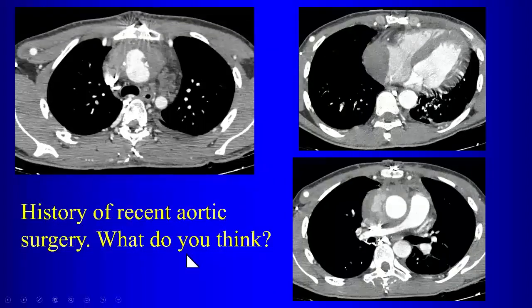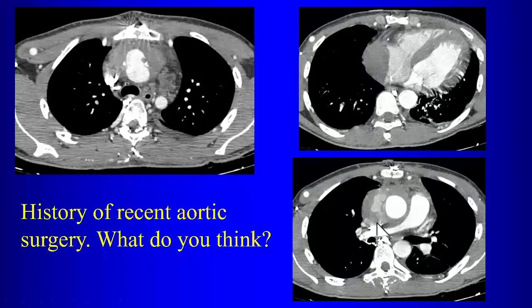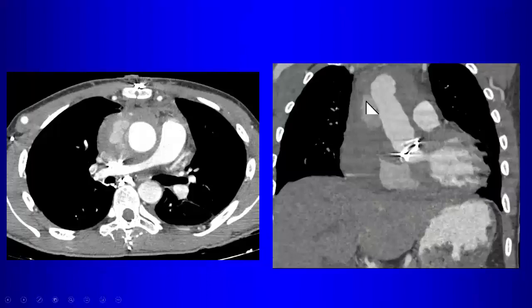In a patient with recent aortic surgery, one must look carefully for hematoma around the ascending aorta — which can be normal in a fresh post-operative patient — but also for contrast extravasation indicating active bleeding from the anastomosis. Graft dehiscence presents as collections of contrast outside where the graft should be, associated with hematoma and potentially sternal dehiscence. Graft infection should be suspected if there are abnormal collections of air more than two weeks after surgery.